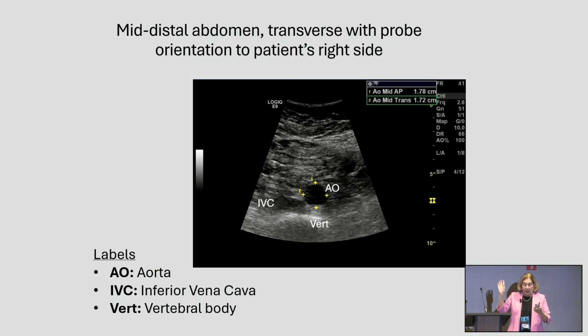When we do this, it's important to know that we approach this, find the aorta, and it may be kind of in the midsection. But how do we divide this up when someone on a worksheet says proximal, mid, and distal? I like landmarks. I like people to have, what do you call proximal, Tina? Should be what I call proximal.